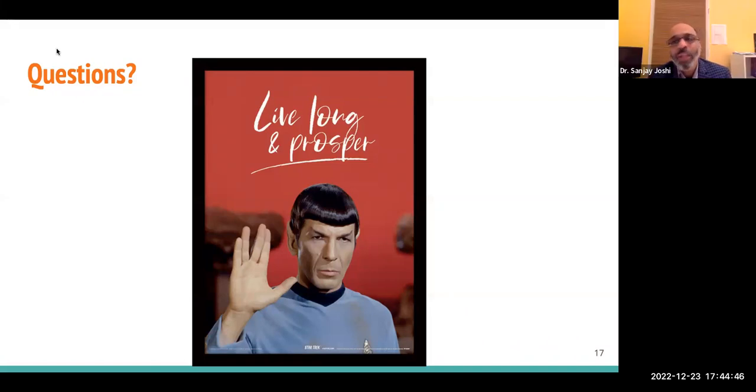Now, for example, when we did the robot, we did a robot that includes navigation using infrared cameras and a robotic arm. At that time, there was no other device that did it, and so ours was the first. So what did we do? We said, well, there is a robot that does not have navigation, and that was our predicate device. And there is a navigation system that did not have a robot. So we used two of them together as predicate devices, and we say, well, we are going to create something that kind of combines these two.